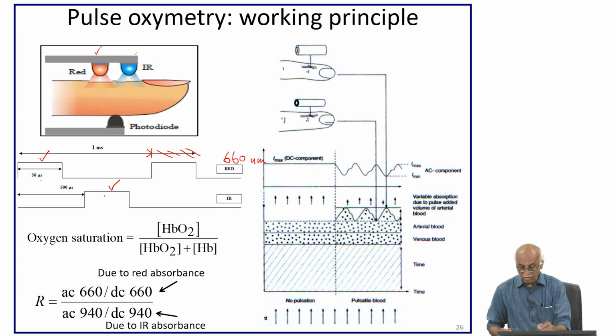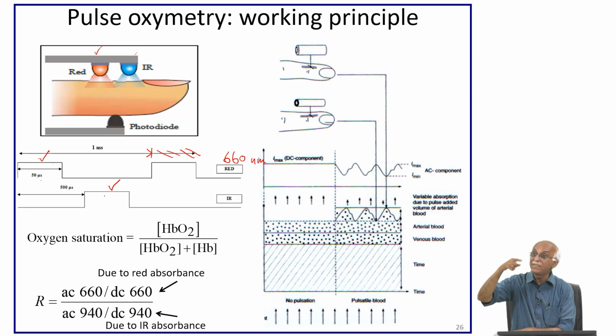Now, the heart pumping rate is approximately 60 to 70 beats per minute, sorry, that is, every 800 to 900 millisecond is one pump. So within that 800 millisecond of the pump pulse of blood being supplied, we are measuring many times how the oxygen variation comes into the picture.